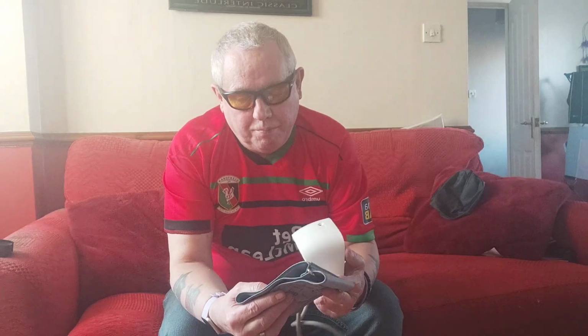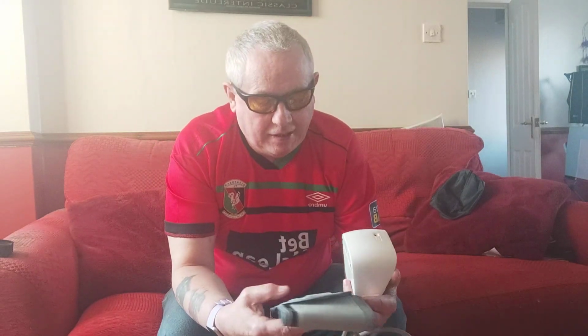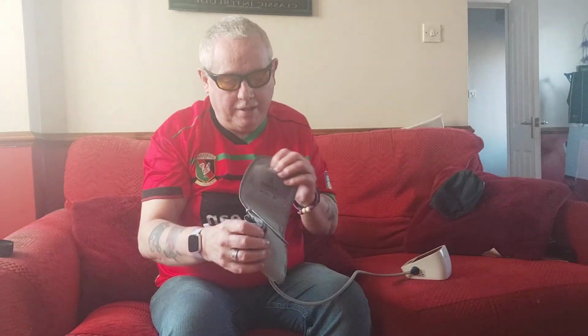really bother me. Whenever you get your blood pressure machine, you take it all out. Of course, you open the back bit, put 2 batteries in, and that's it. There's the instructions on the cuff. It's dead easy. So I'll show you what you do. You unzip this bit here, right?